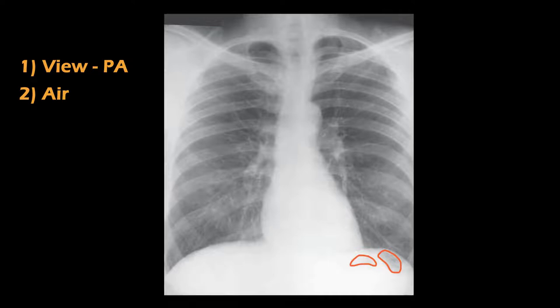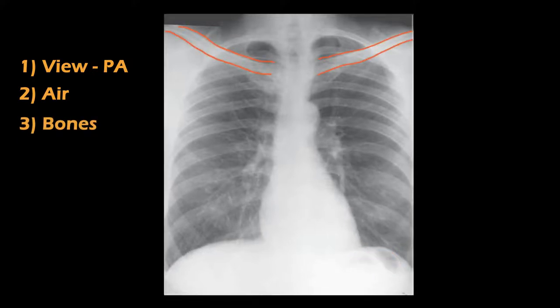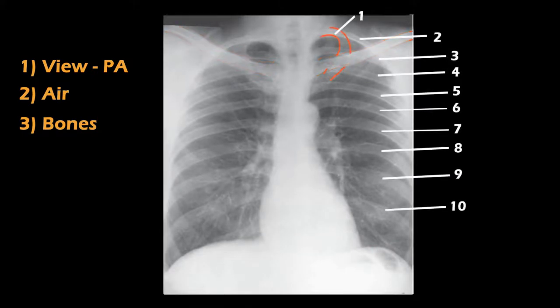Now coming to B, that is bones. Let's label all the major bones seen here. These are the two clavicles. These are the ribs, seen very clearly — this is the first rib, the second rib, and so on. Remember, these parts we see are the posterior parts of the ribs. They are seen prominently because they contain more calcium, hence they block more x-rays and cast a better image than the anterior parts of the ribs.